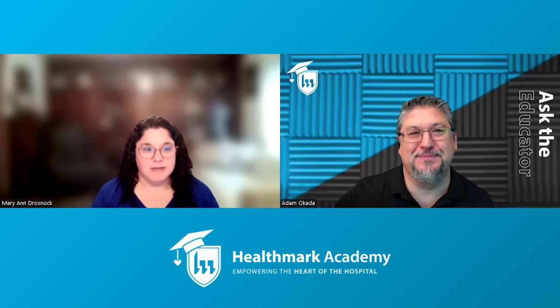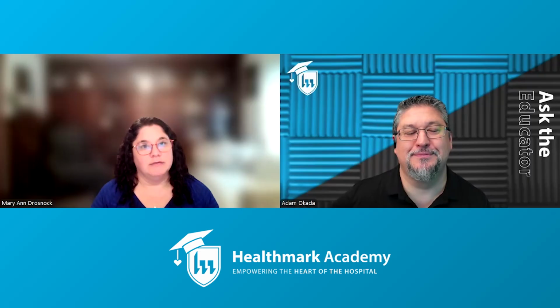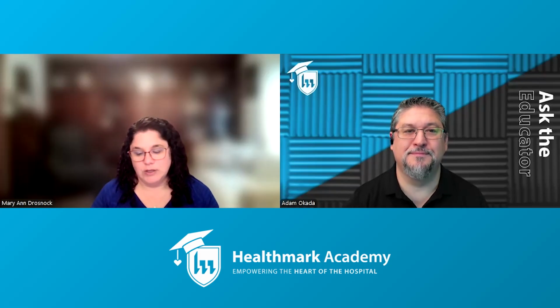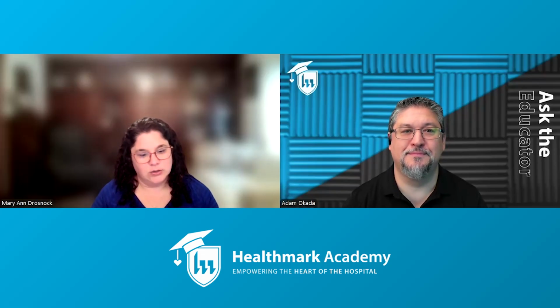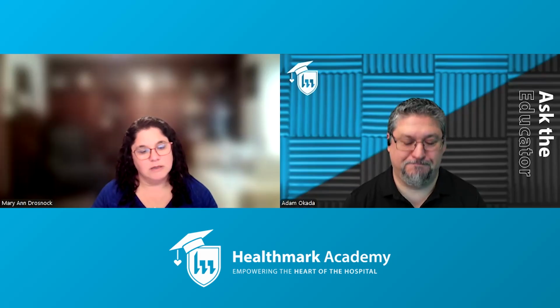Sure. When we were developing ST91, we landed on the language of having a category of endoscopes called high risk scopes. Those are scopes that have been more frequently implicated in outbreaks and cross contamination. They may just be more complicated by nature, harder to reprocess, and therefore have a higher risk associated with their reuse and reprocessing. So we thought it a good idea to designate those as high risk, which is the first time we've really seen that done in a standard or a guidance document like that.